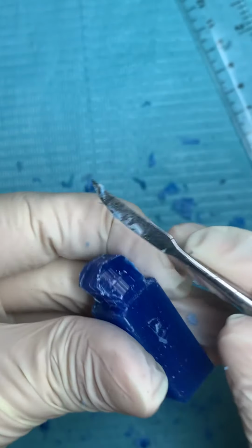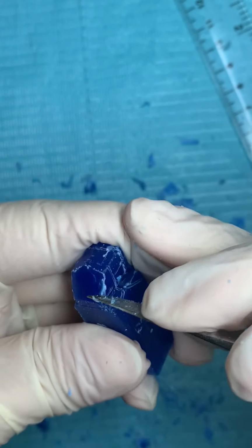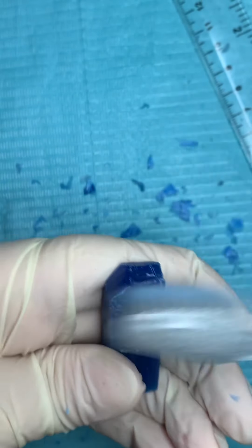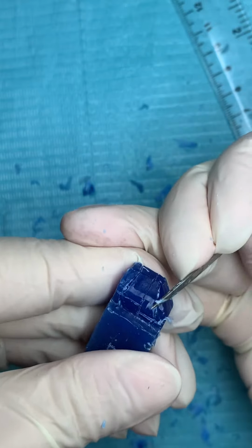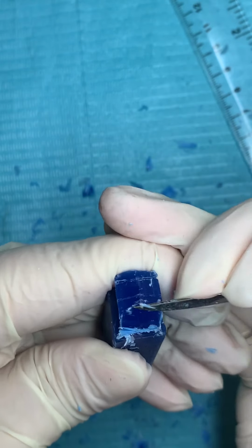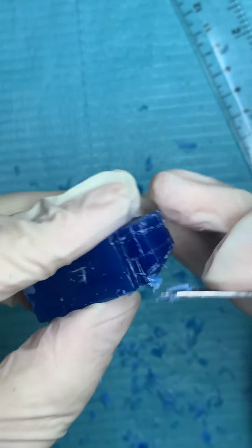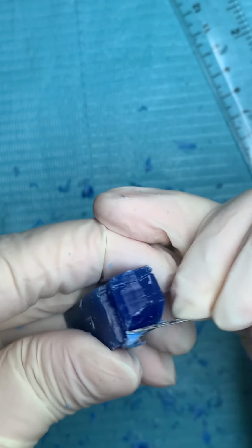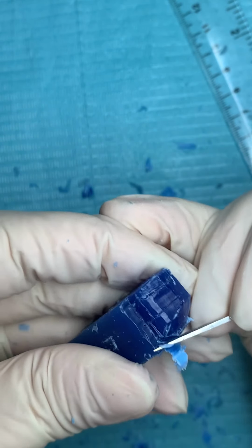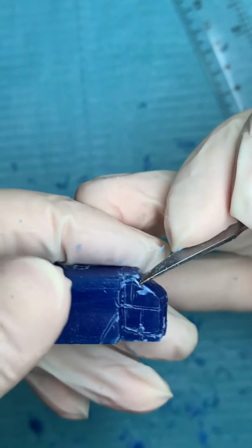Usually use again the flat area of the carver to make flat surface. Go exactly as you are drawing. Here I need a flat surface, but not concave. Get sure that it is flat till the point of the height of contour. Then at the height of contour, go down like this. Now another plane. From here, go and cut. Then join in the middle part.